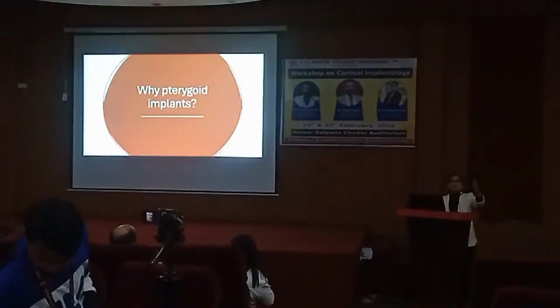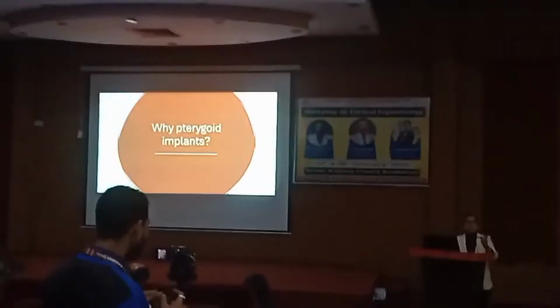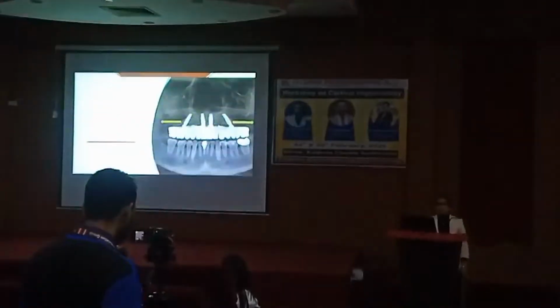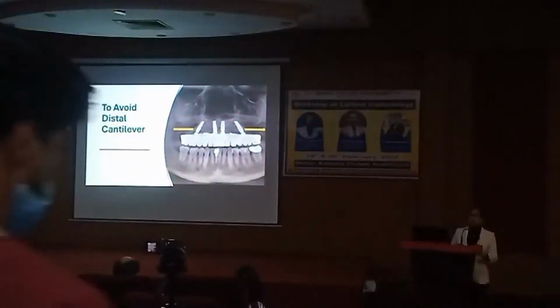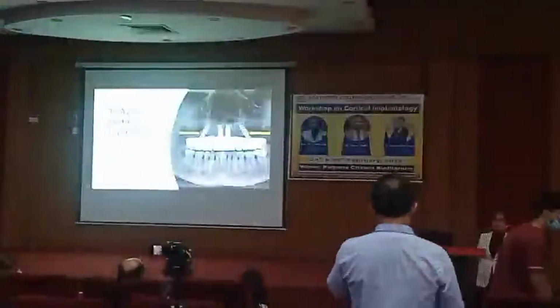So the question arises, why pterygoid implants? Why do we need pterygoid? So what was the requirement for the emergence of a newer technique for pterygoid? Number one reason is to avoid the distal cantilever. For those who are practicing implantology and those who are doing full mouth cases, they know that it is very difficult with the distal cantilever.